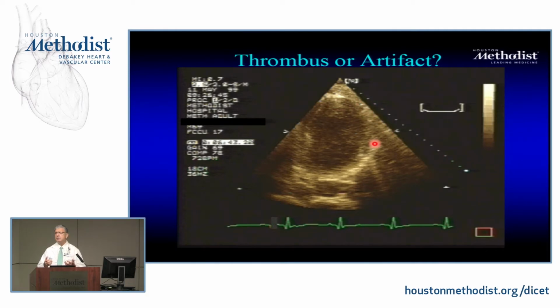Interestingly enough, at times you may also have reverberations with the casing of the transducer. So the transducer, I send the ultrasound, it goes down and then gets back, and it gets reflected back from my transducer, which has casing and everything else, goes back and forth. So you may have at times reverberations here. That's why this apex doesn't look as good. And interestingly enough, we're going to talk about harmonics. Harmonics takes care of that. And that's why harmonics has been so useful, it takes care of some of these reverberations.